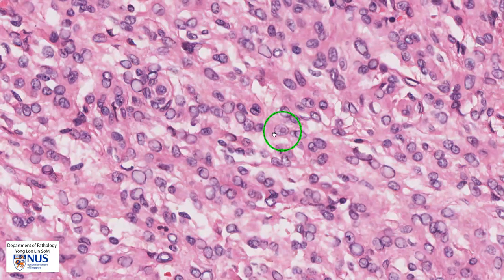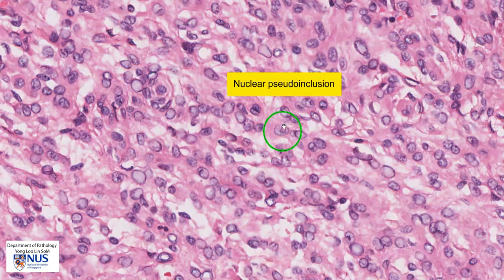Here is another feature to highlight in a meningioma. This is a nucleus, but within the nucleus there is a little island of cytoplasm, which is pink and appears the same as the cytoplasm of the cell. This is a nuclear pseudo-inclusion, which is an infolding of the nuclear membrane, and this is also a feature that is quite frequently seen in meningioma.